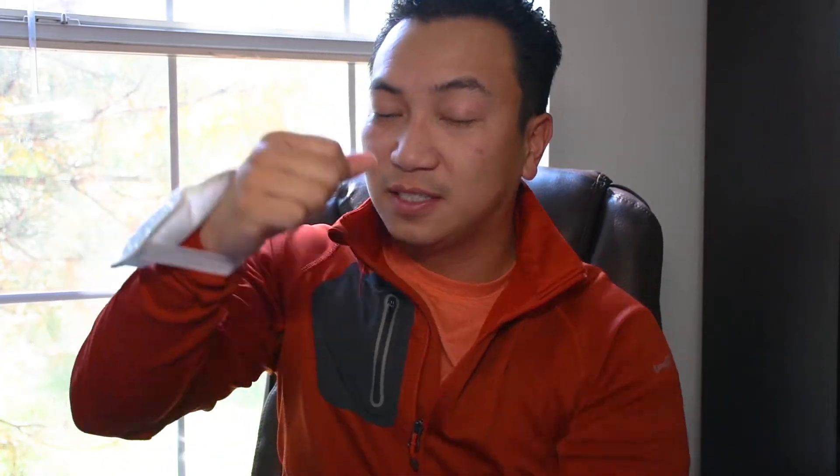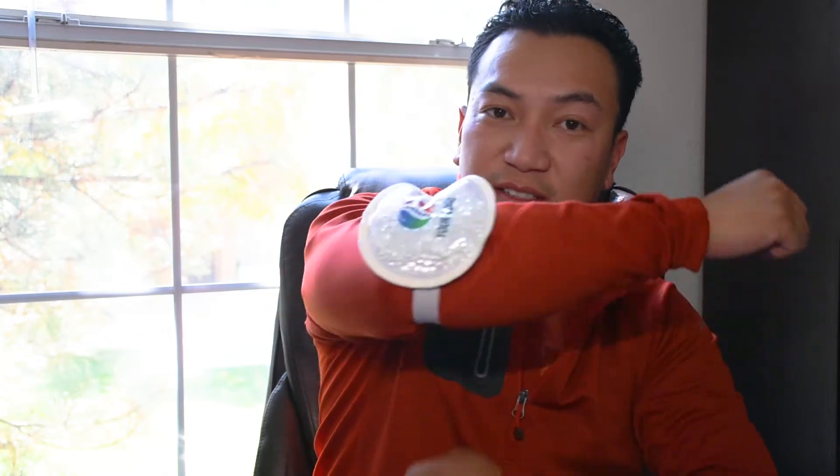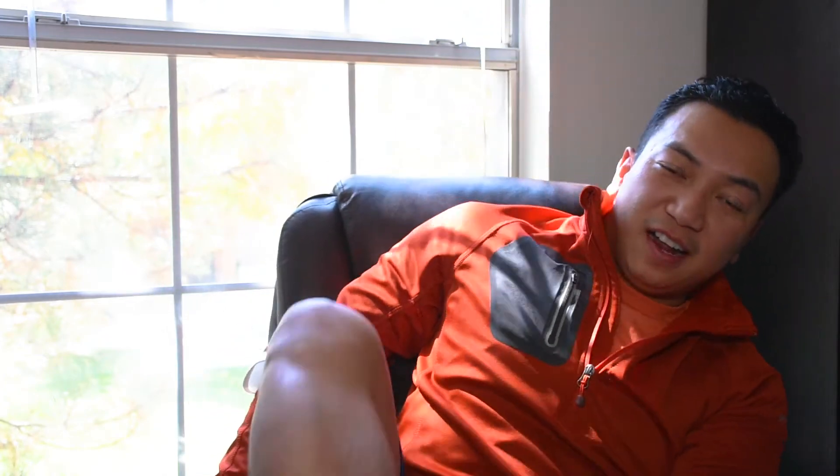It has a nice plush on the back and a nice elastic strap, so if you are sore on your wrist you just strap it on. If you're sore on your elbow you just strap it on there, and if your ankle is sore you can just strap it on there too.